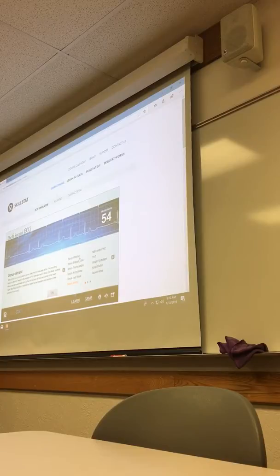So let's go through our sinuses. Here's a sinus rhythm. Honestly, when I'm playing the game, this is the one that trips me up the most because I'm looking for something wrong. And yeah, this is the hardest one. But everything's normal there. Everything's normal here except for slow. But everything's marching out nicely. This one we're just quick.